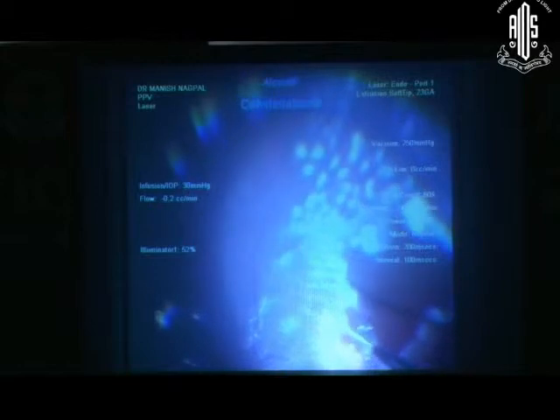And now you see that there is a mild traction here which is still there, which has come up and is allowing a few PFCL bubbles to migrate inside. So that means that traction is not totally gone. Otherwise, usually that would not happen if you've relaxed it further. So the essence of showing this case was that I planned to do a certain amount of retinectomy, but I ended up increasing it to a large extent.